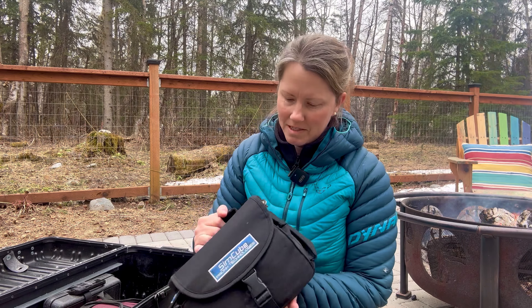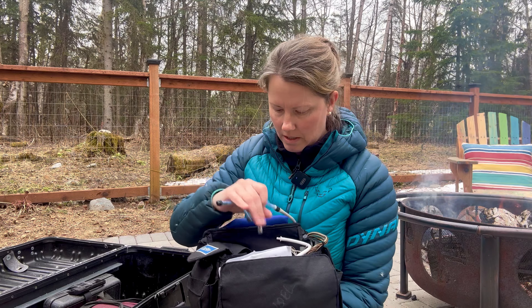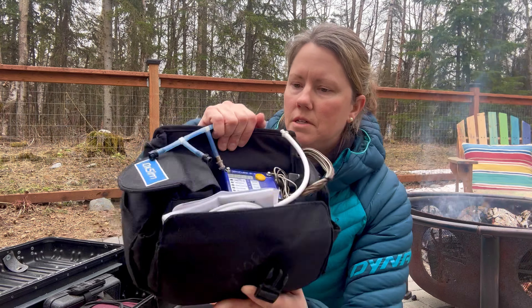This is my SimCube — I use the heck out of this thing. This is the SC5, and it has really held up to the test of time.